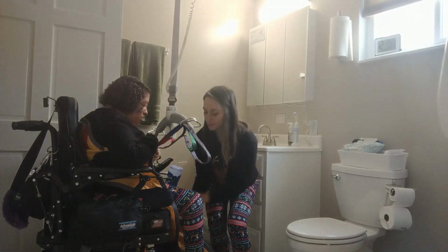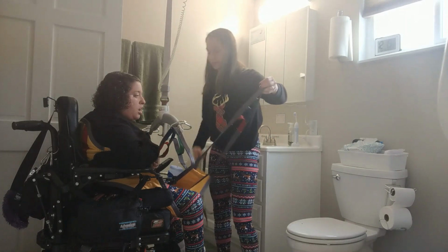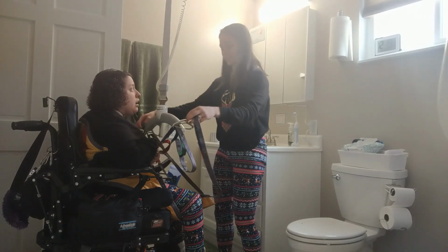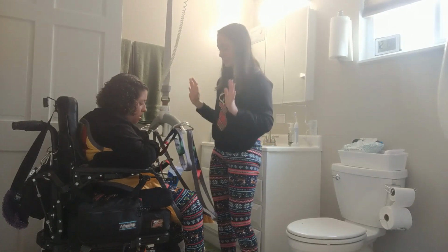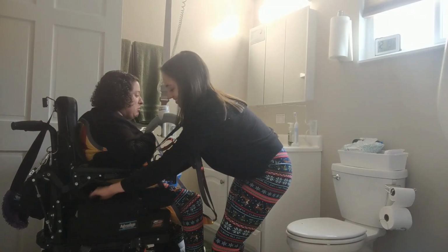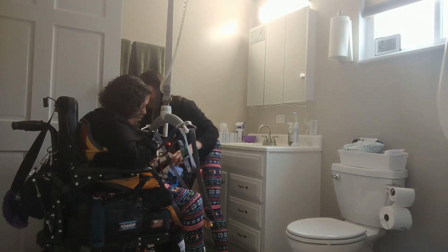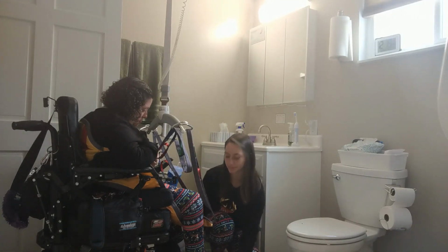And then with the leg straps, you're actually going to cross them to the other side so that she doesn't fall out underneath. Right, and so my hips stay at that 90-degree angle again, and my legs stay directly under me. And then make sure you do all that before you unbuckle her. Yep, because safety first. We make sure we're secure in one system before we unsecure in another. Undo her feet straps.